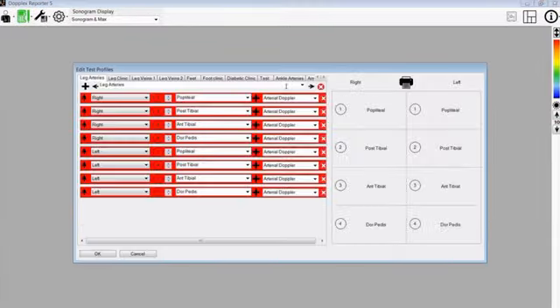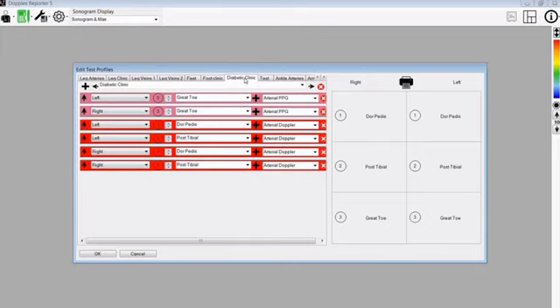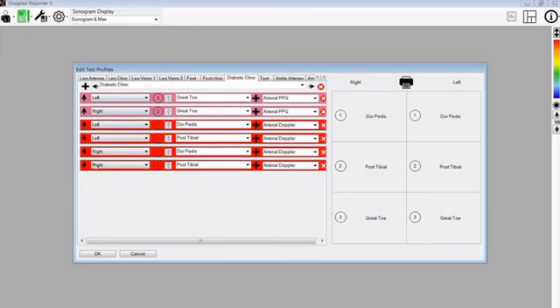Looking at edit test profiles again, there are mixed profiles. For instance, you can select a diabetic clinic. Here we have toes and vessels from the ankle. Again, these are done in this order, so we will do toe pressures first and then ankle pressures.